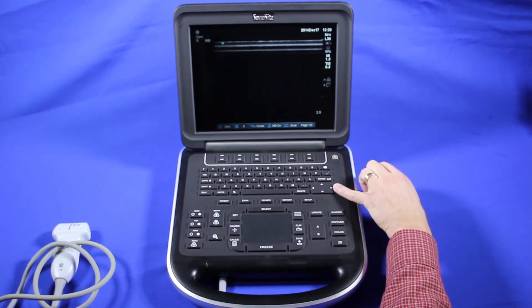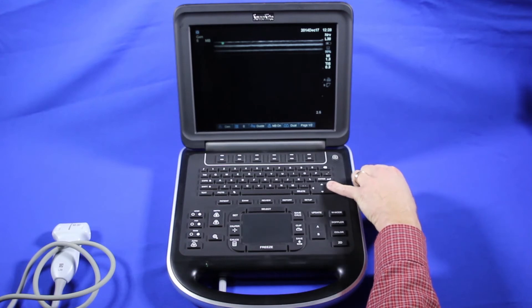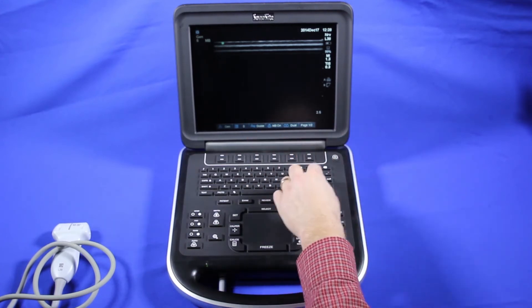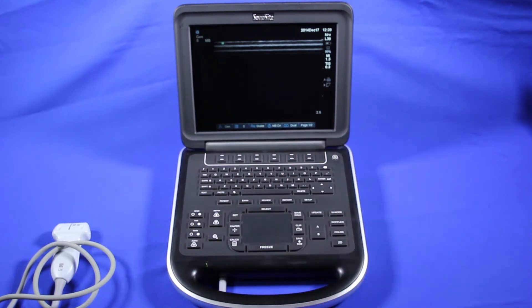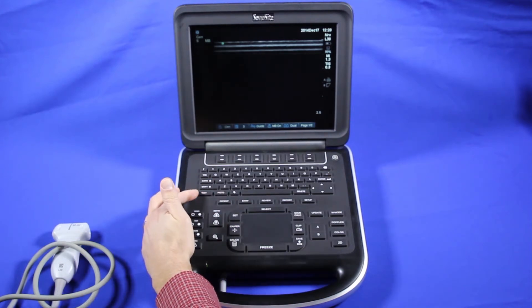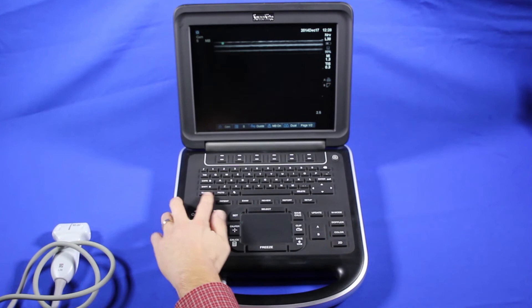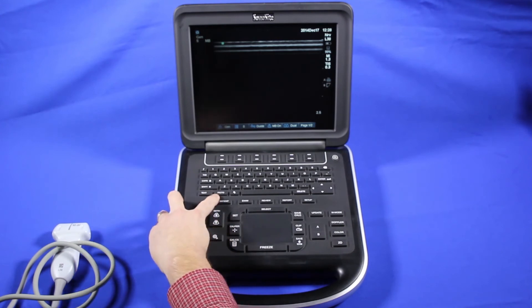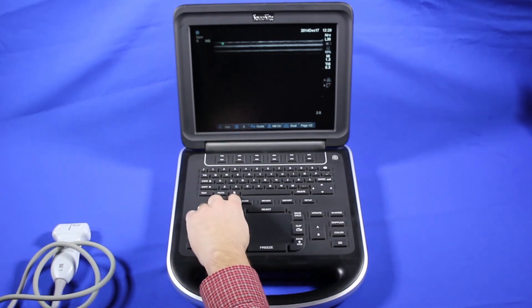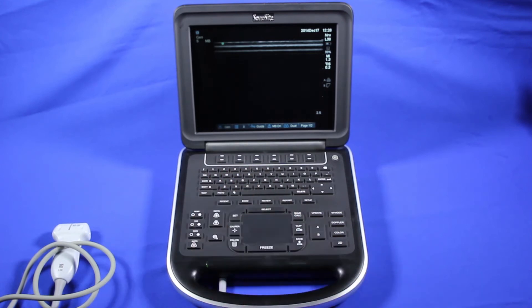On the keyboard, the main things you need to know are the arrow keys, which will move color boxes and do various things we'll show later in the training. Text, which will get you a text box to write on the screen for annotations. Picto, for pictograms, also known as body markers. And your arrow key. Everything else is pretty standard on the keyboard.